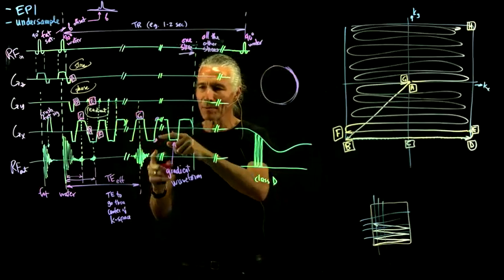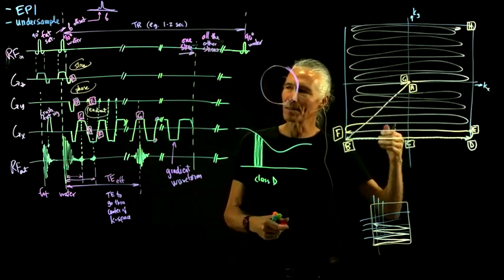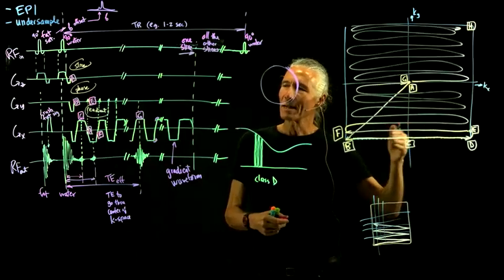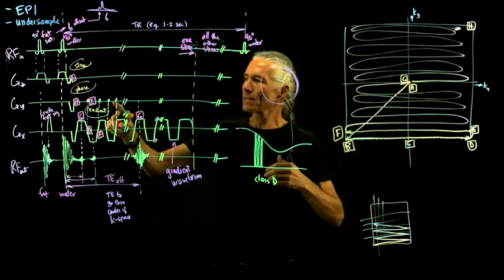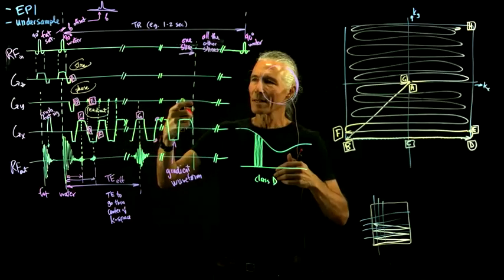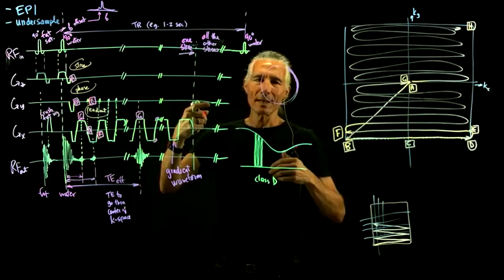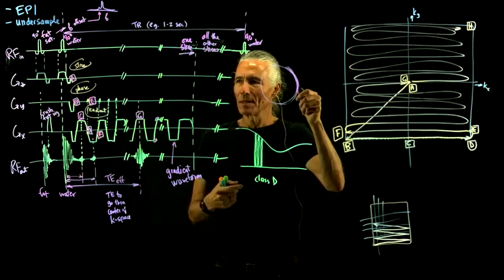It's less of a problem here. You've got these giant gradients because these are like muscling things around, and so you don't have problems in the kx axis. But these little gradients are so small, and you're doing a long readout, like 50, 60 milliseconds of data, and so there's more chance for that to cause a problem.